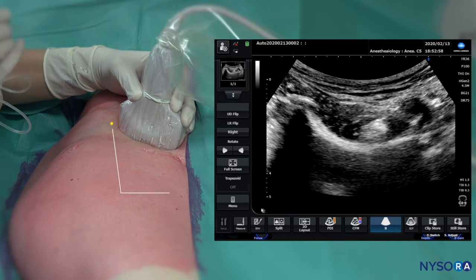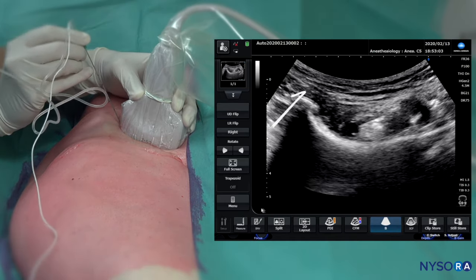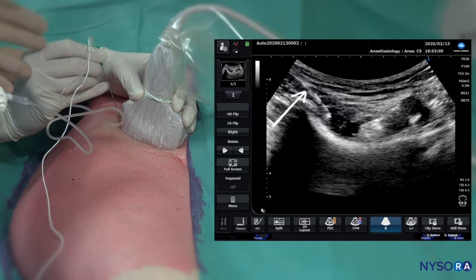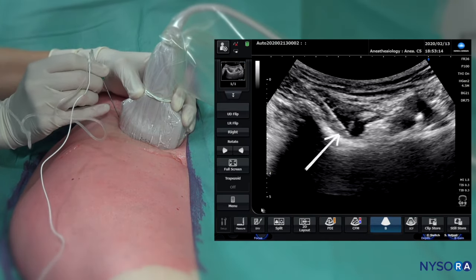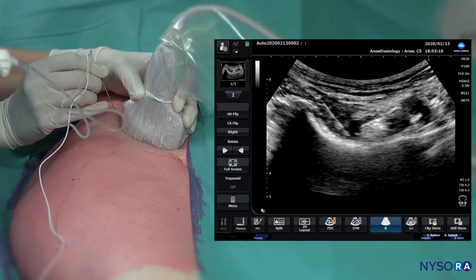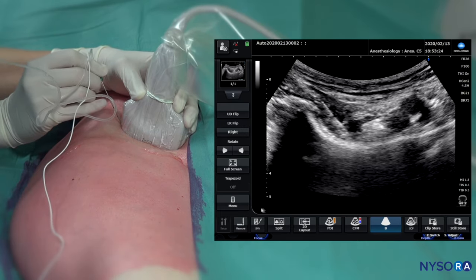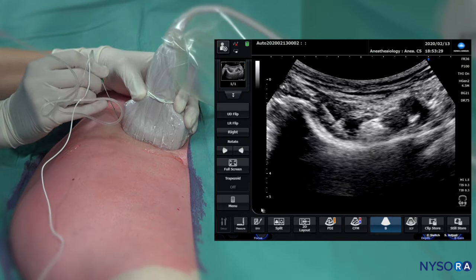The needle insertion will be very steep. Using an in-plane approach, we can see the needle as it approaches the anterior inferior iliac spine. Using a slightly steeper angle, the needle eventually lands right on the pubic ramus, slightly lateral to the tendon of the psoas muscle. Aspiration is negative, the twitch is absent, and injection pressure is low.